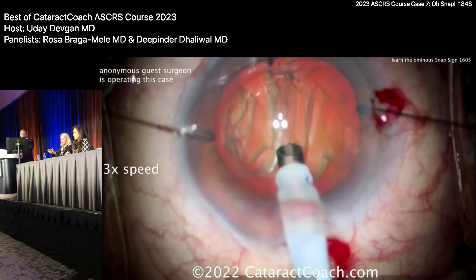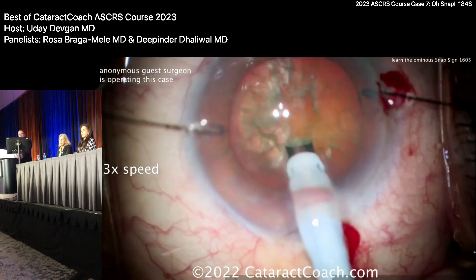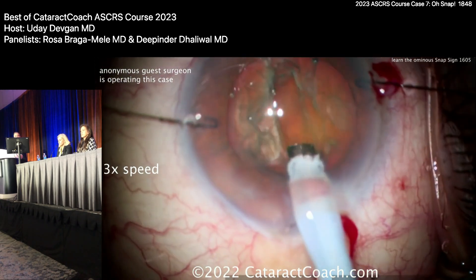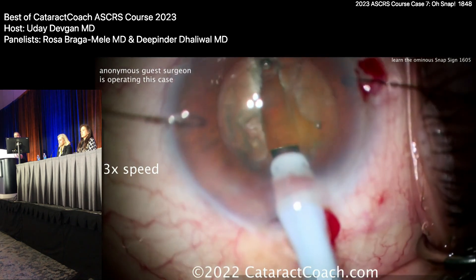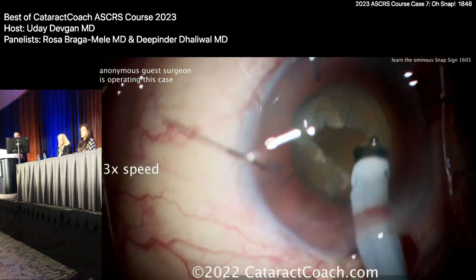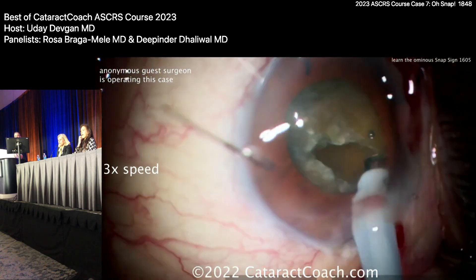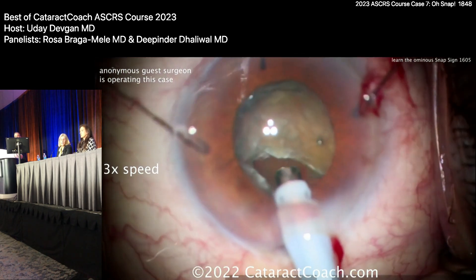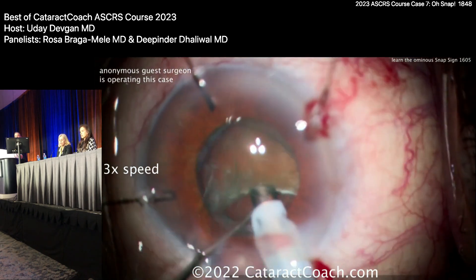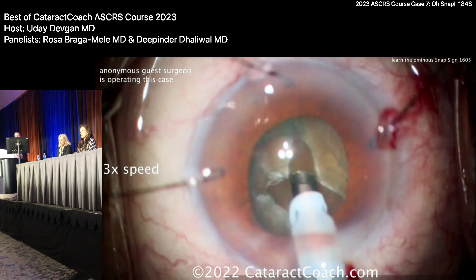If you have pressure right from the beginning, the fluid will go posterior. So we'll get some iris hooks in and go ahead with nucleus removal. Here's a groove down the middle — they thought it was floppy iris, I'm not sure. We're all here to learn together, so I'm really honored that people submit these cases anonymously — that's how we learn from each other. Watch carefully: the video is sped up. It's trying to get the nucleus rotated — rotating — and it looks pretty deep back there. Buzzing in again on the probe.